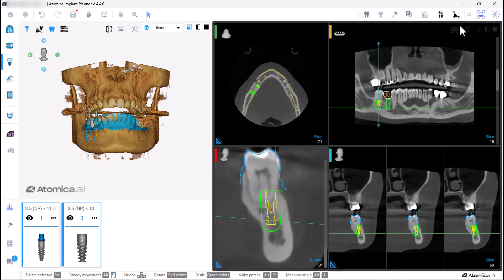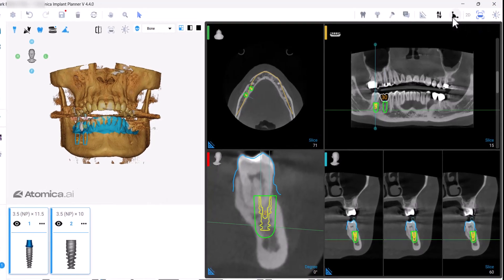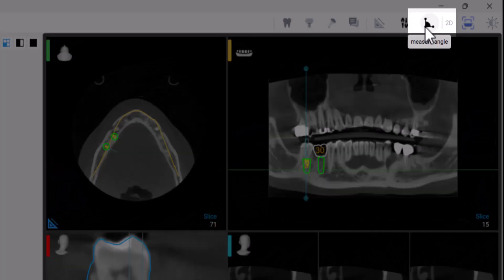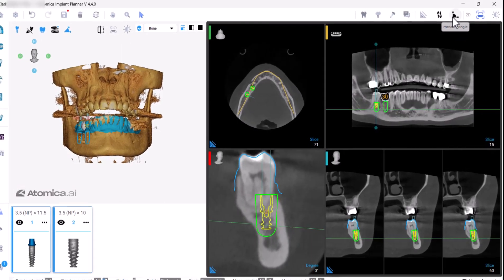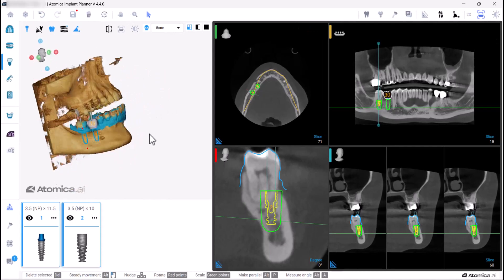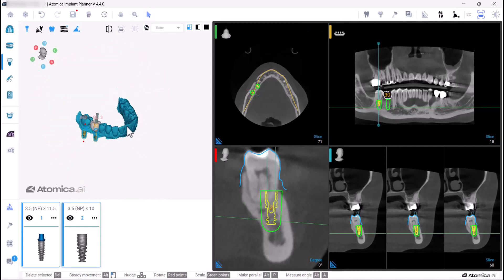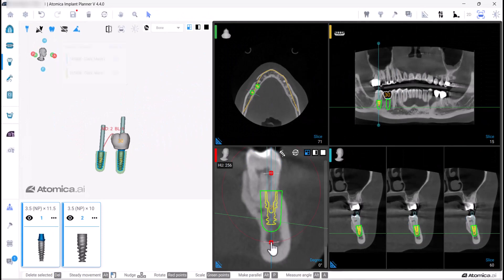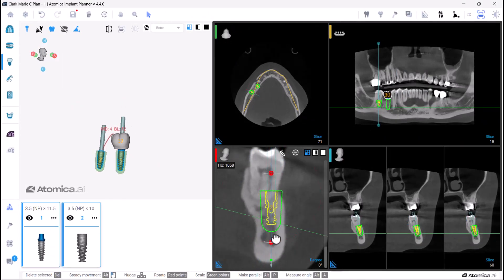Click the Measure Angle button and the measurement will instantly appear on the 3D view. You may need to make a parallel relation between them — select the implant whose angulation you want to preserve, then hold the Control button and select the other.